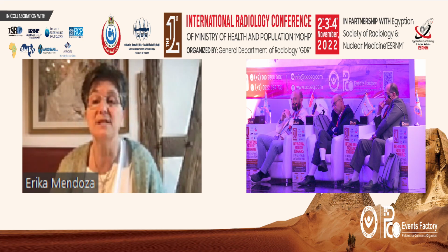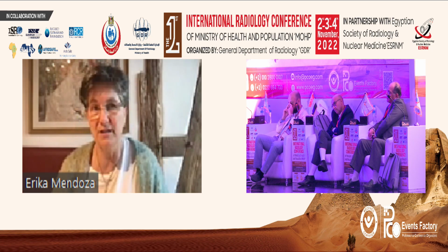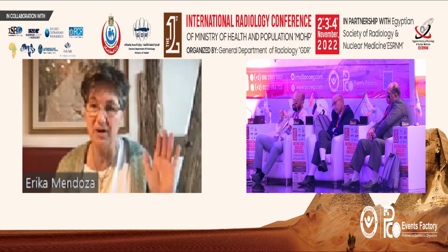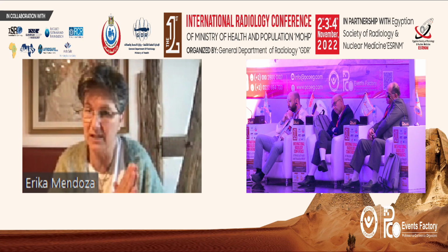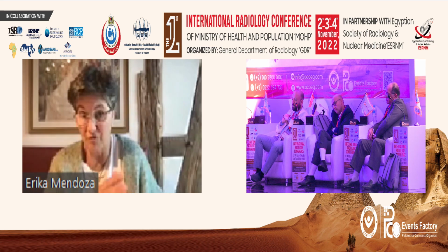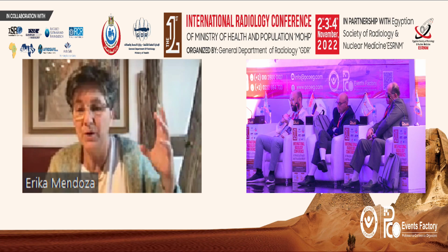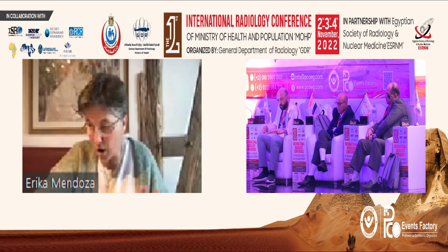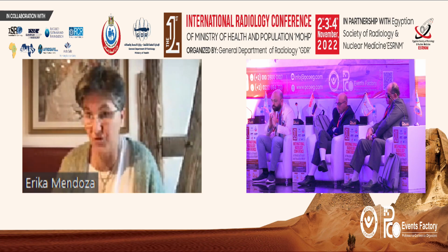So I treat these patients when I see that they have edema, that they wear stockings and this helps, but they want to get rid of them and so on. If I find this reflux, they are so happy if you get rid of it. Often it is a very tiny refluxing surface that you can foam, or laser, or strip, or do whatever you want, because this relieves their pain. And so I document this long-lasting reflux, which makes it evident that there is a reflux.